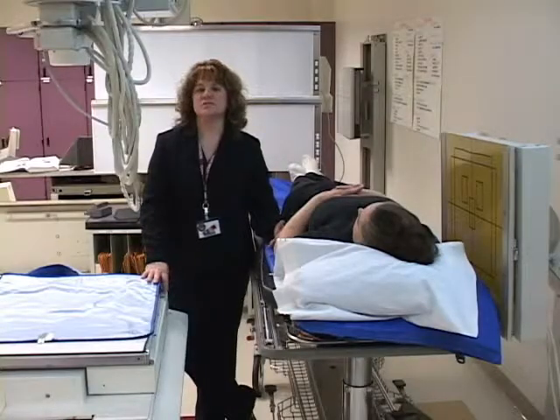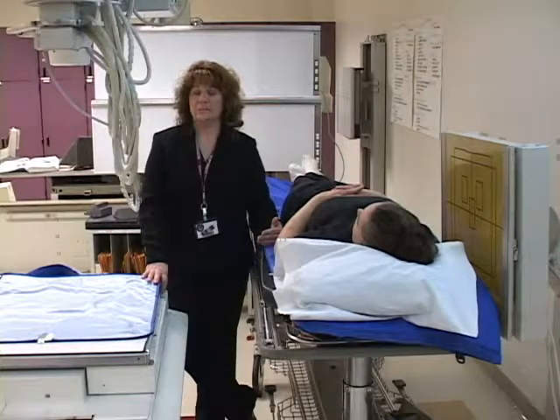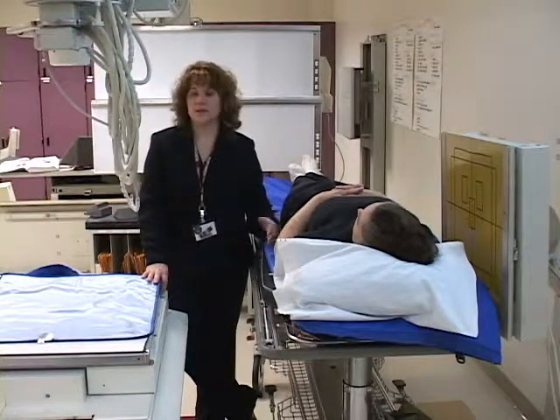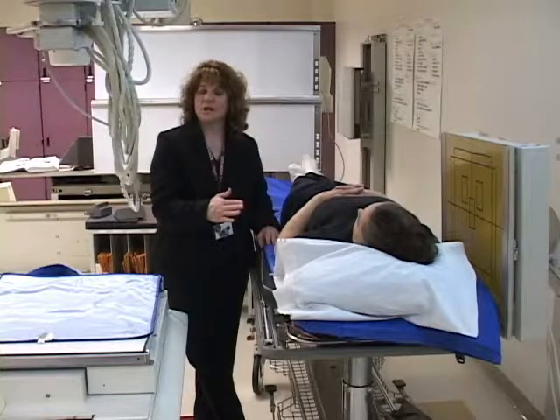Okay, I'm going to demonstrate a decubitus abdomen this time. This again is for a patient that is unable to stand, but we want to see air fluid levels. In this particular case, we're not going to shield the patient because that will obstruct the area that we're trying to see. So I have brought the patient in on a gurney.